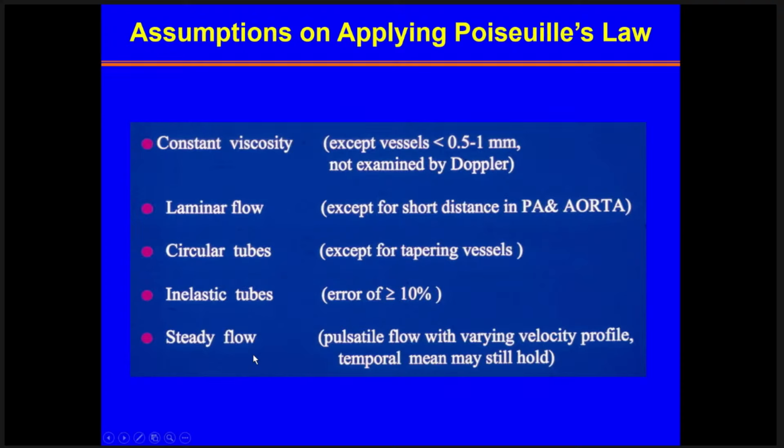Last is the assumption that the flow is steady. It doesn't change. As you know, again, flow is pulsatile with a varying velocity profile. However, one can look at the temporal mean, and relations using the temporal mean can still give us useful information.